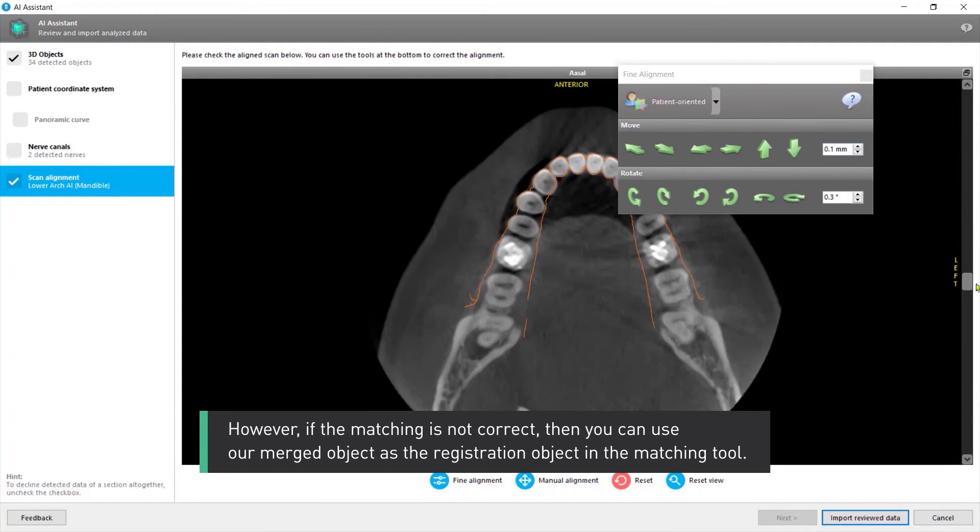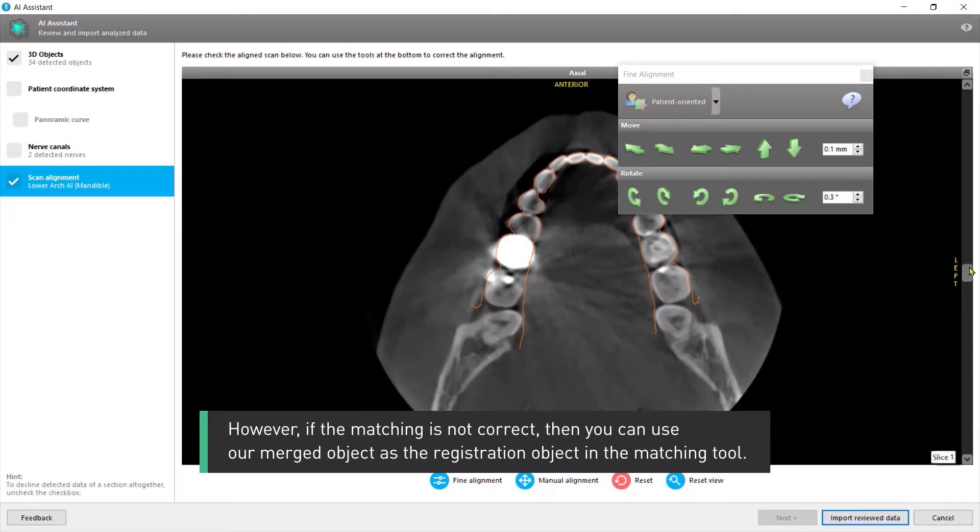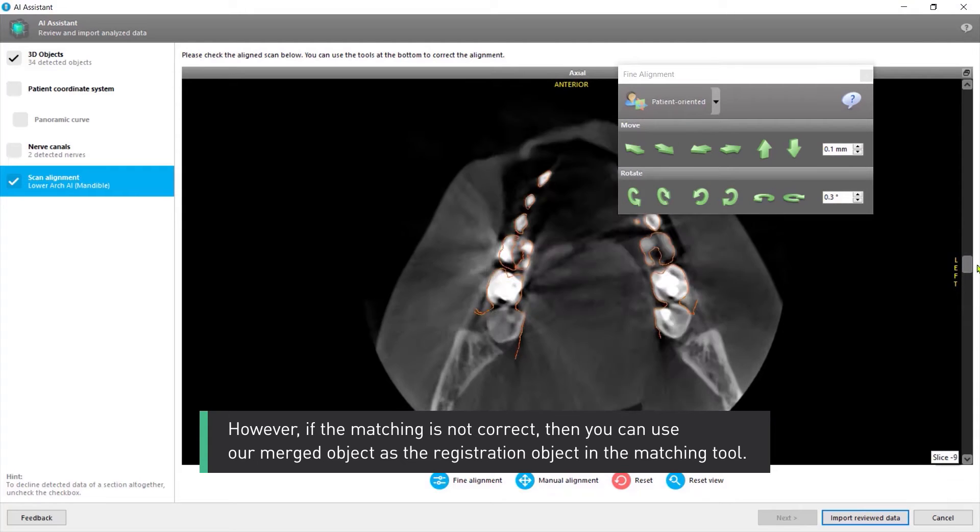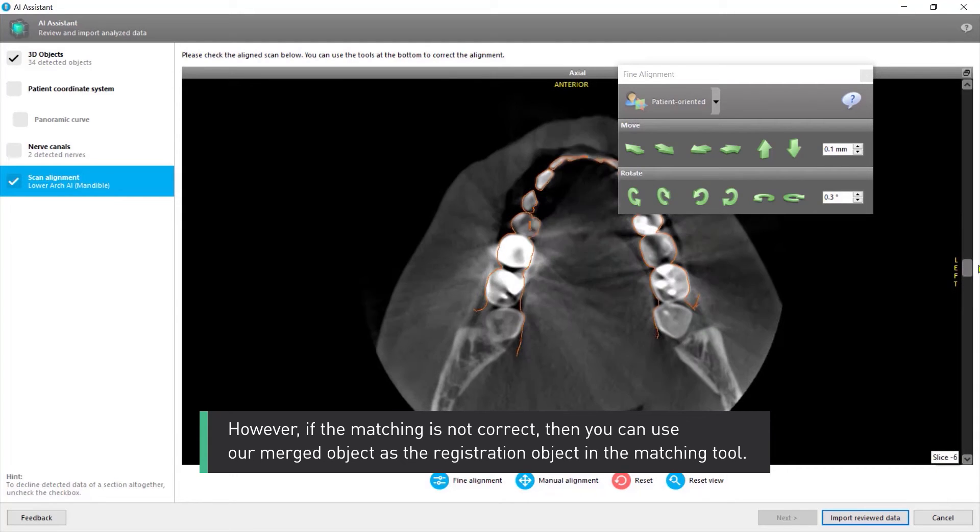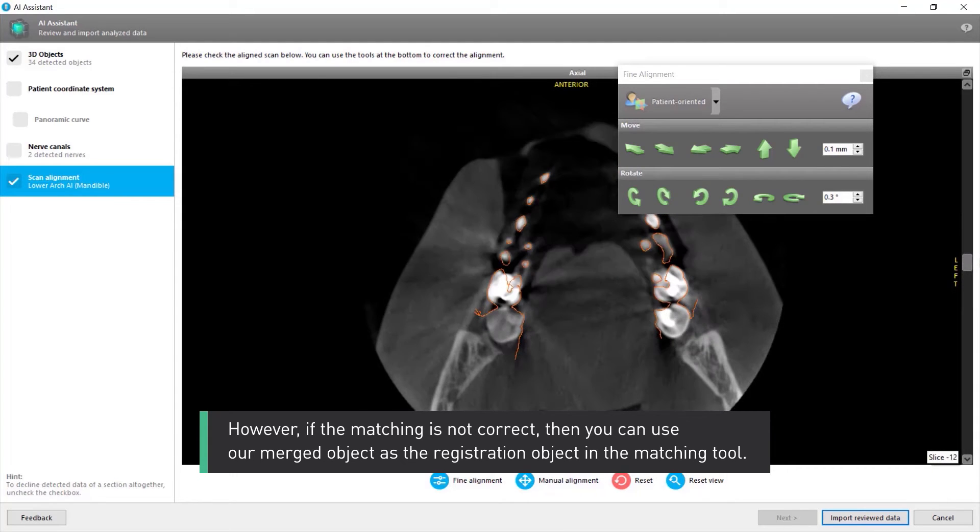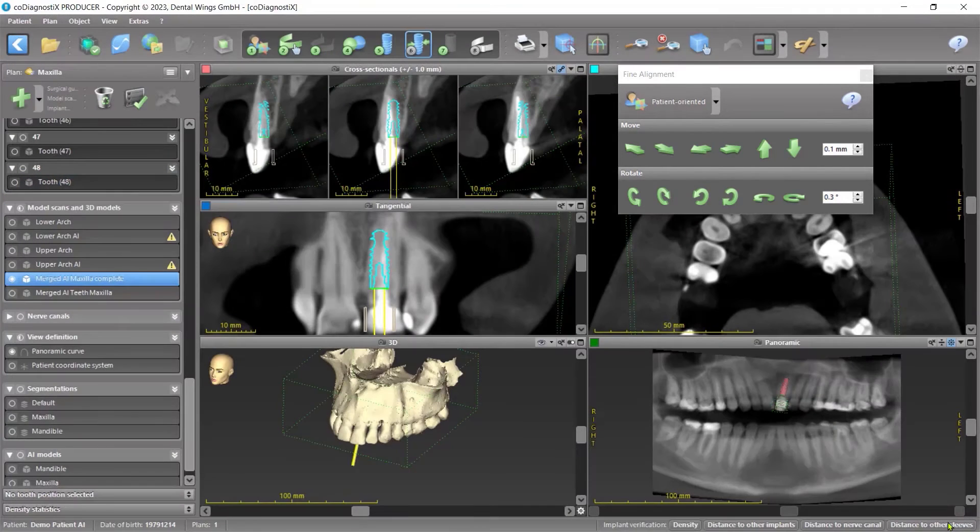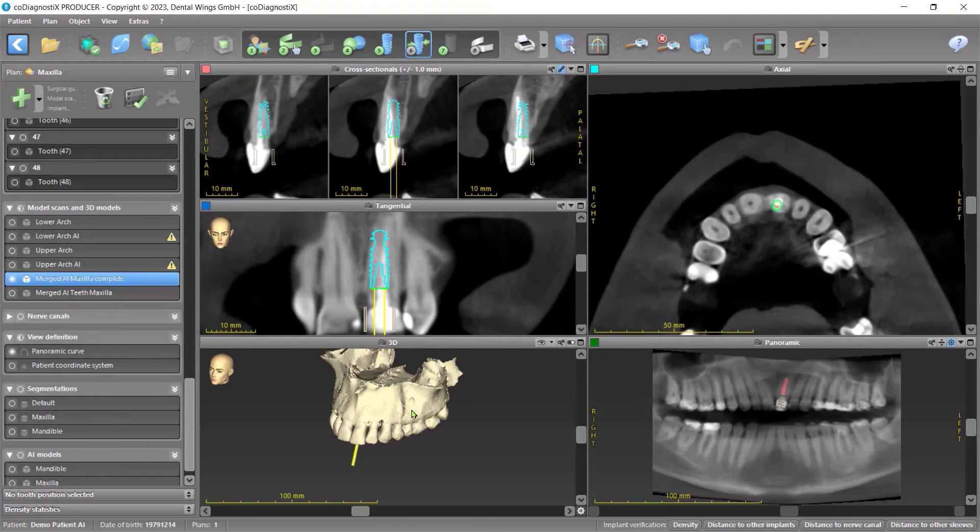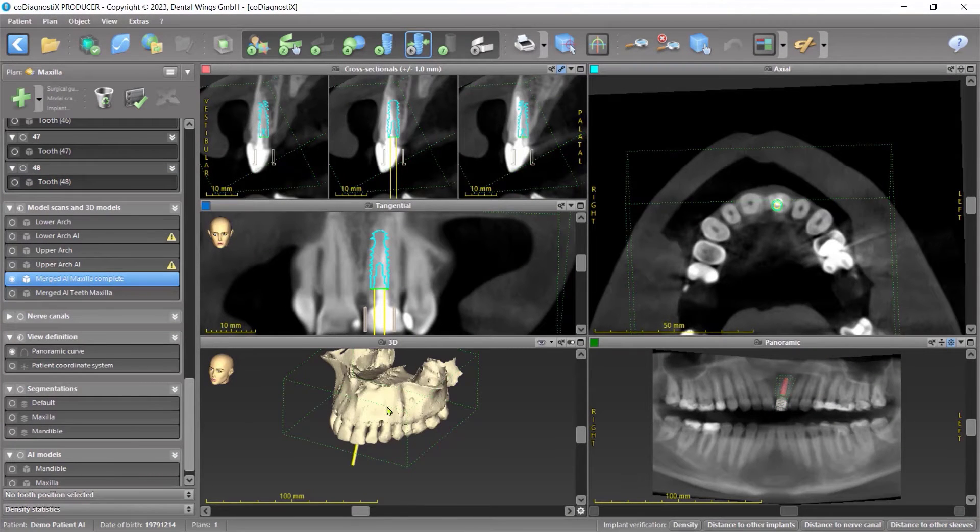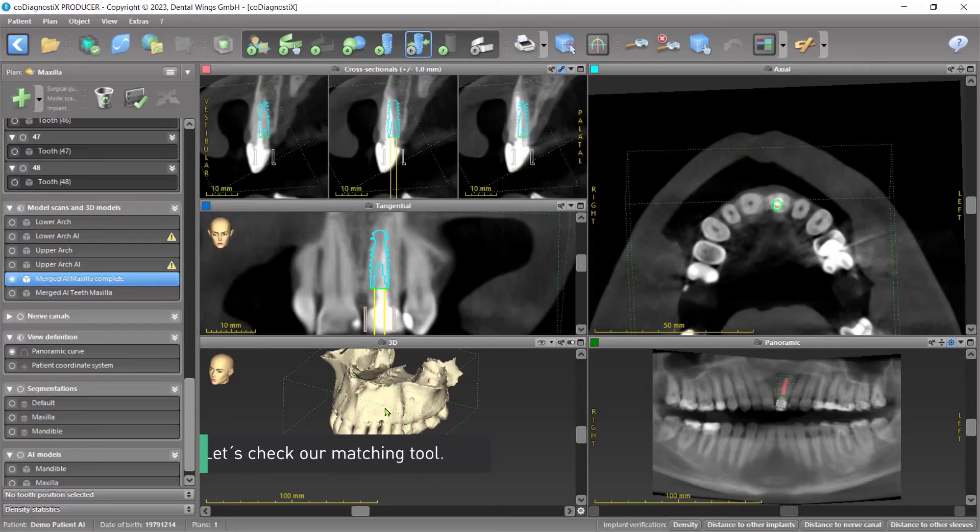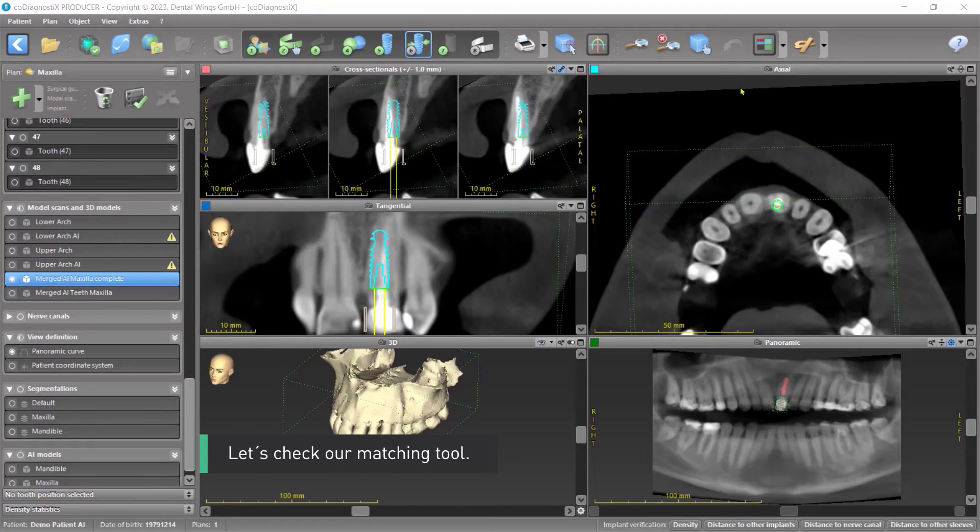However, if the matching is not correct, then you can use our merged object as the registration object in the matching tool. Let's check our matching tool.